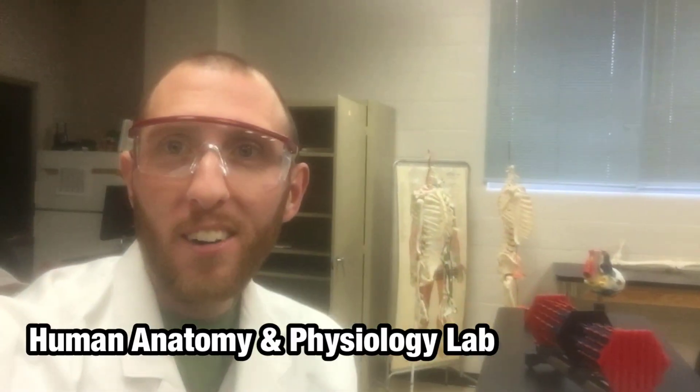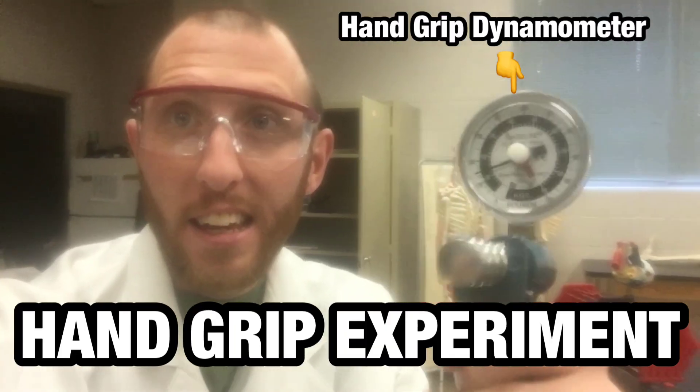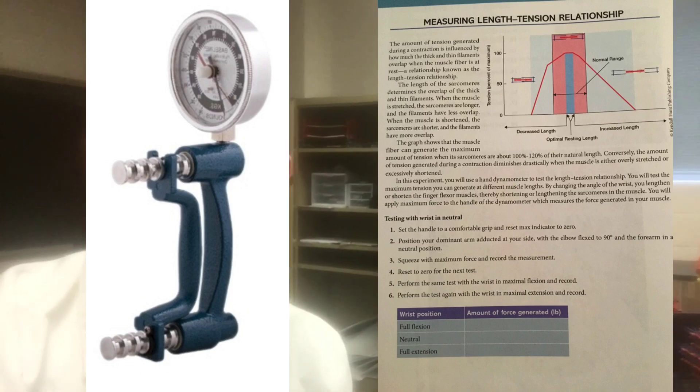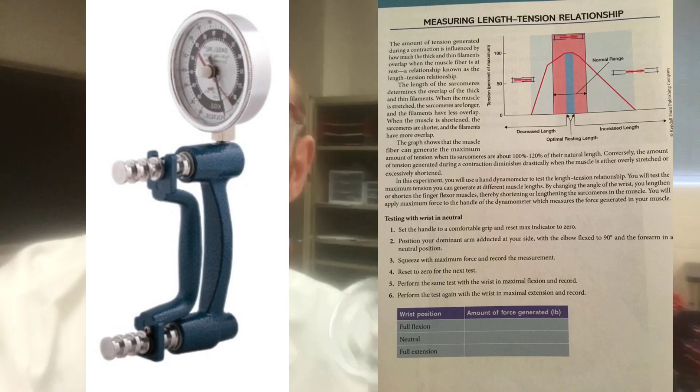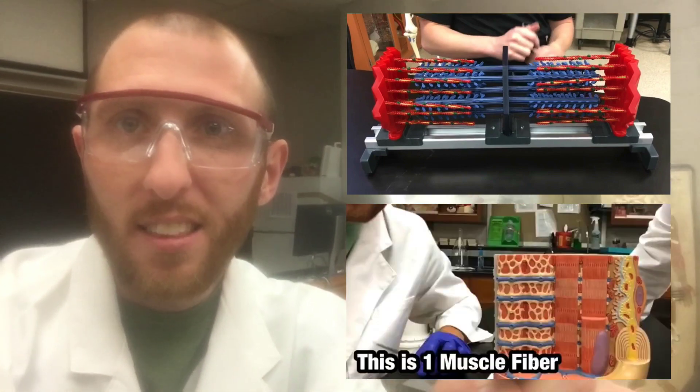Hey everybody, today we're talking about the hand grip dynamometer and the hand grip experiment from your lab manual. We're going to tie together everything that you know about the sarcomere, the muscle fiber, and muscle strength. So let's go through the experiment.